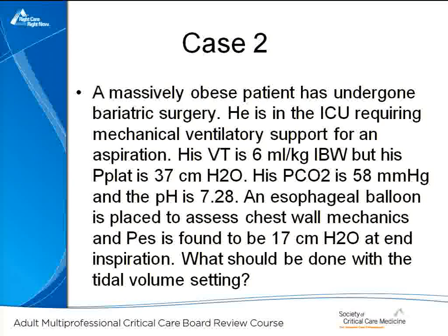Come on. There we go. So the correct answer there is to decrease the rate. That was the one choice that actually reduced minute ventilation. Everything else there either kept things the same or made things worse. And again, I'll reemphasize one more time, you're going to almost assuredly see a question on air trapping on critical care boards.